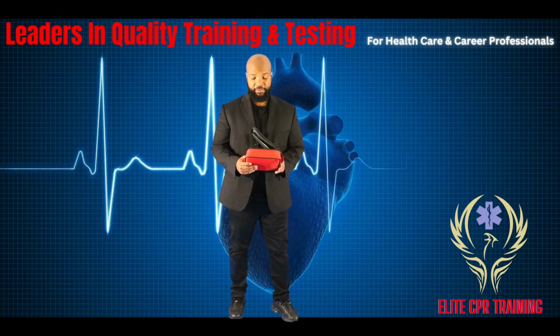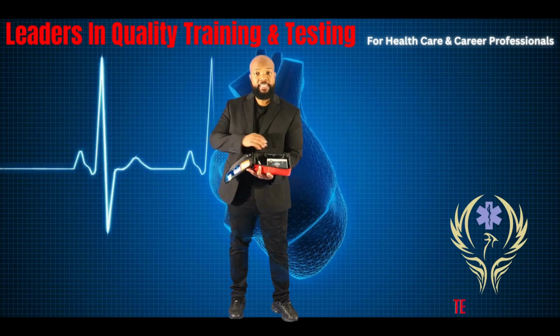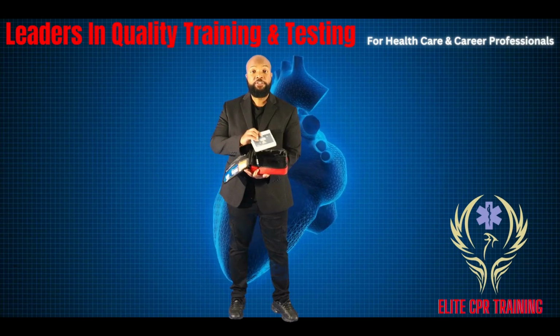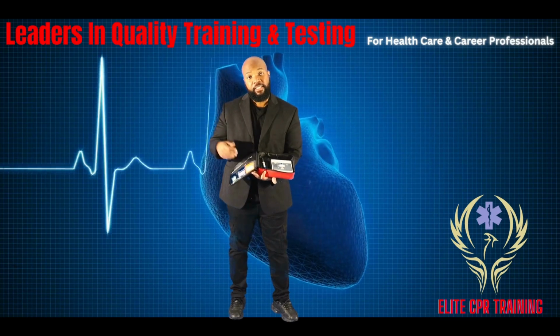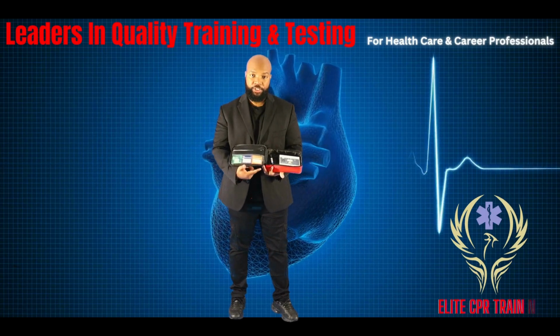Turn on the AED. Some AEDs you may have to open up the carrying case to power it on. Other AEDs you may actually have to push a button to power it on. After you power on your AED, then you're going to follow the prompts. Listen to the AED. The AED is going to tell you exactly what to do. Some AEDs may have pictures to indicate exactly what to do.